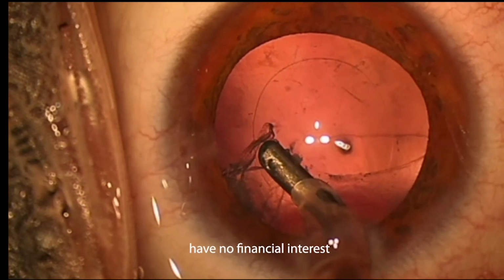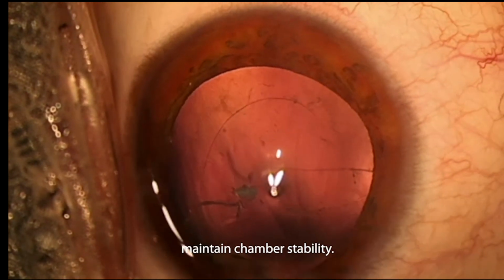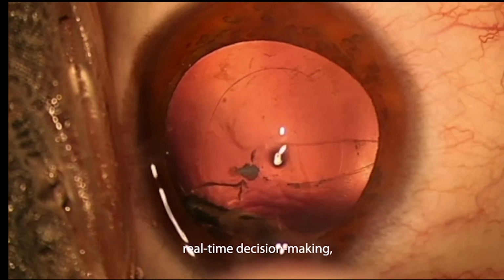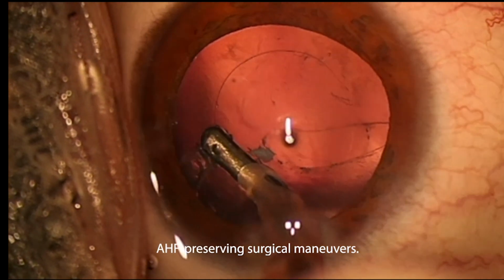I have no financial interest in the use of active fluidics, which helps maintain chamber stability. The Flutter Sign enables real-time decision-making, allowing the continuation of AHF-preserving surgical maneuvers.